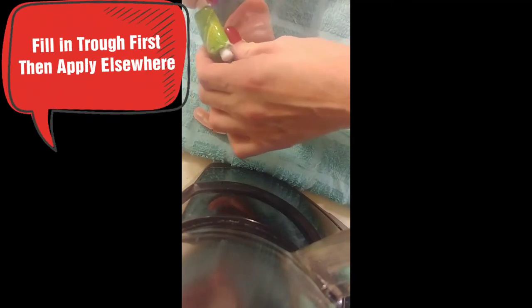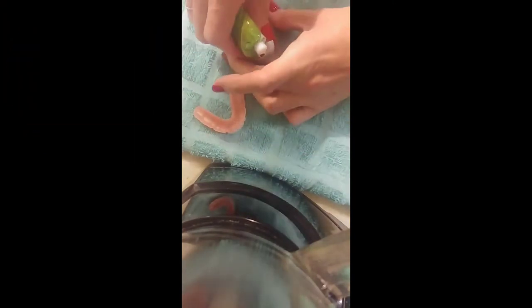Per instructions, it says to get around the trough area. I want to make sure I get my cream in the trough area — the tube lines right there. I'm going to make sure to put my cap back on and take my mold.